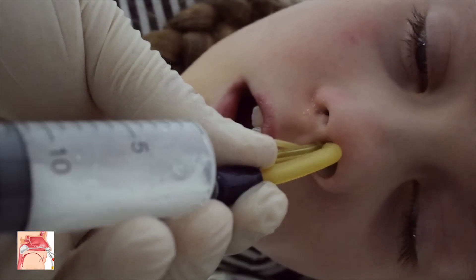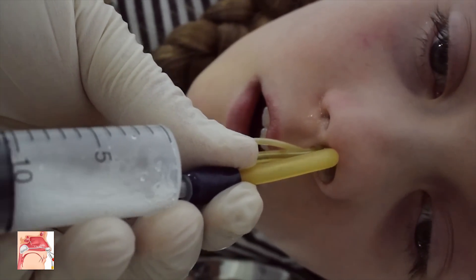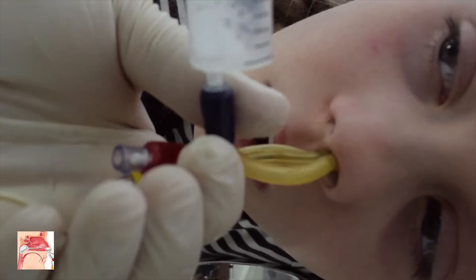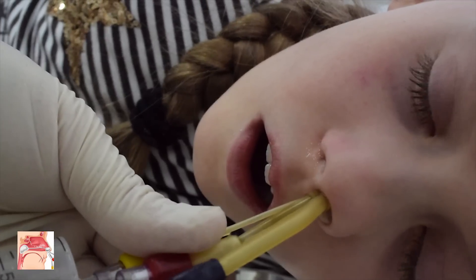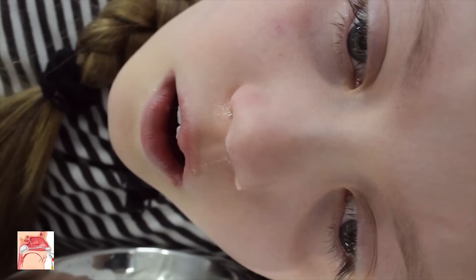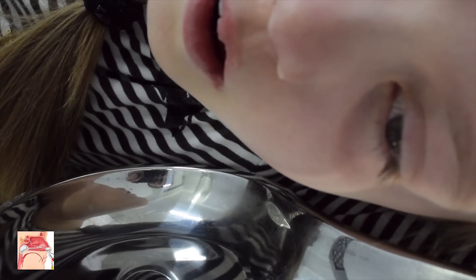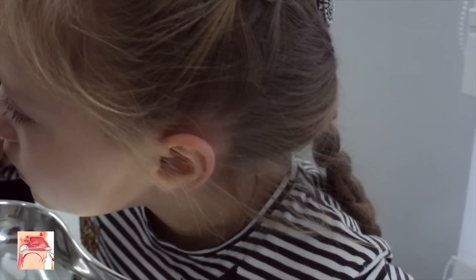The physician performed 90 back-and-forth movements of the plunger. As a result, 10 milliliters of the antibiotic solution were injected into the sinuses in just 50 seconds. There is no nasal discharge after catheter removal, meaning the entire drug stays in the sinuses. During injection, there were no signs of the drug getting into the patient's pharynx, confirming the solution did not proliferate beyond the area restricted by the inflated balloons.